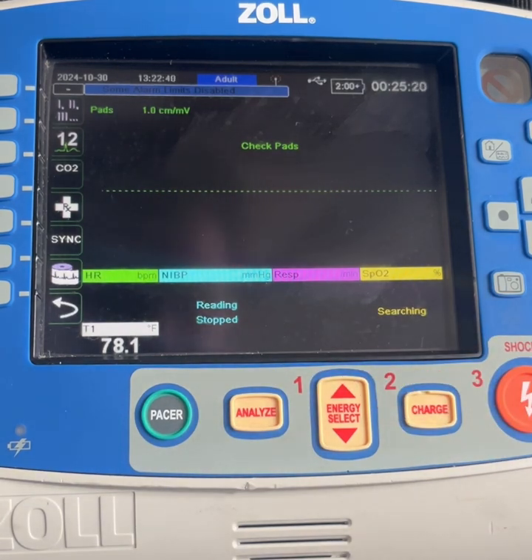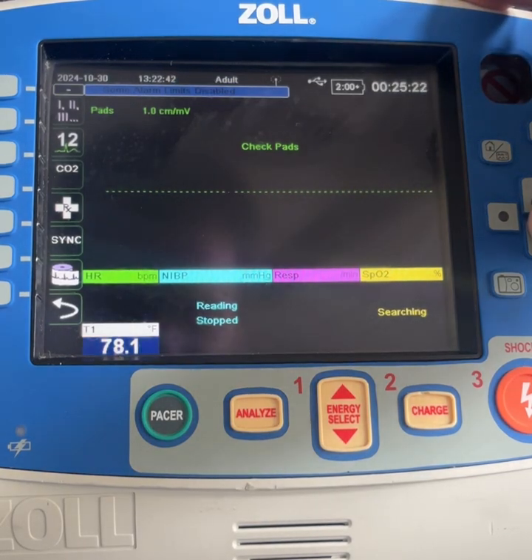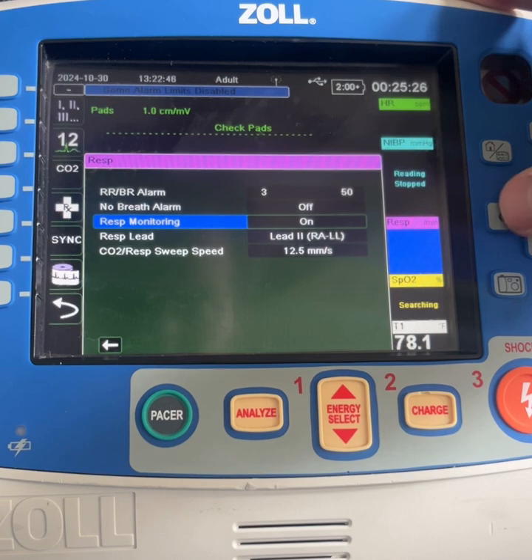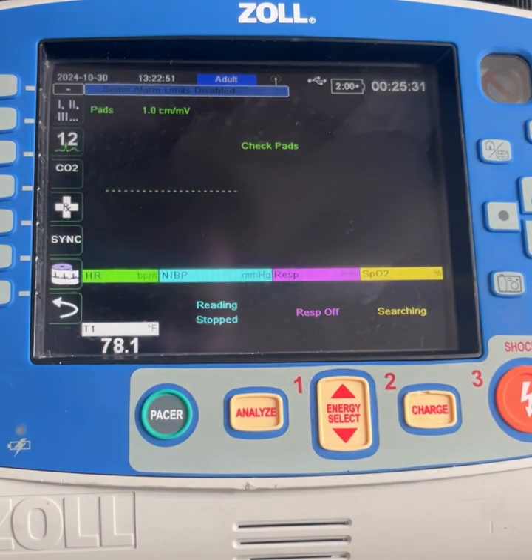If it does not for some reason, you want to scroll down to that section, hit ENTER, and then go down to where it says RESP monitoring and turn that OFF. You're going to hit the HOME button and you should see that. So then going forward, every time you turn the monitor on, that will be deactivated.